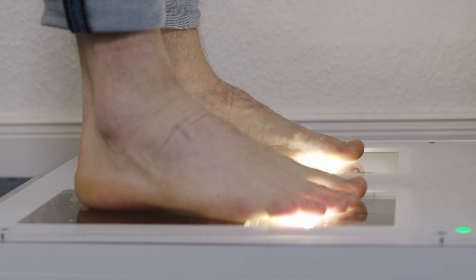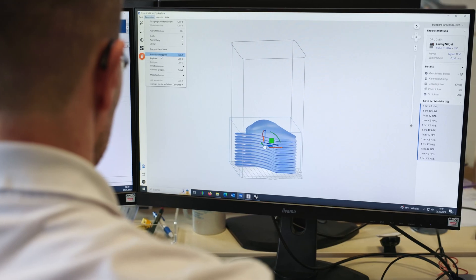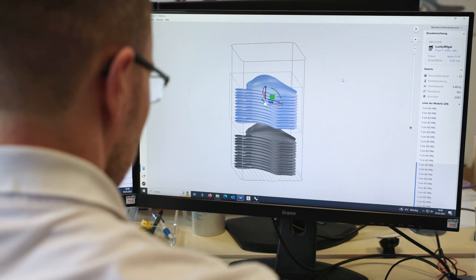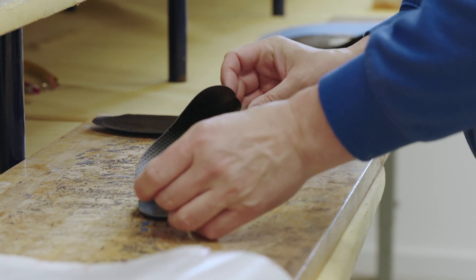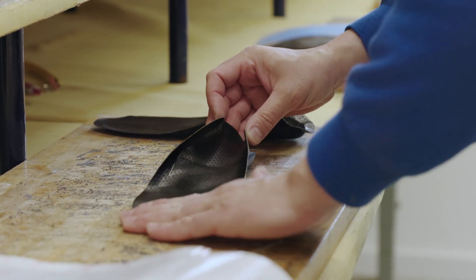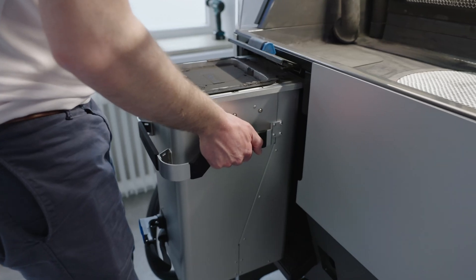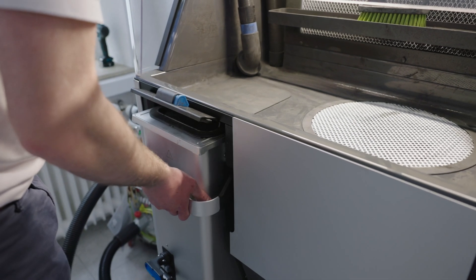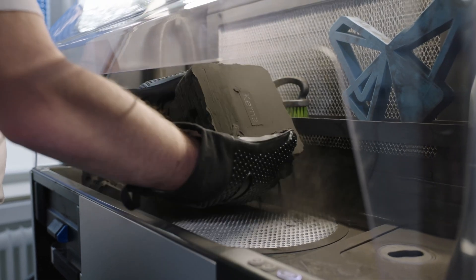The way the digital workflow works is that we do a 3D scan. We use these 3D scans to model the custom insole digitally and then we produce them on a 3D printer. After that, the custom product is handed over to the workshop and post-processed using the traditional workflow. The new workflow enables us to simply take a 3D scan, create the model on the same day and get it 3D printed overnight. The next day, the insole is ready for the customer.